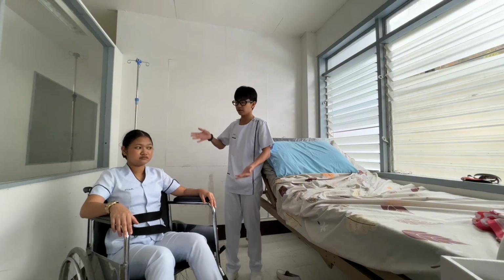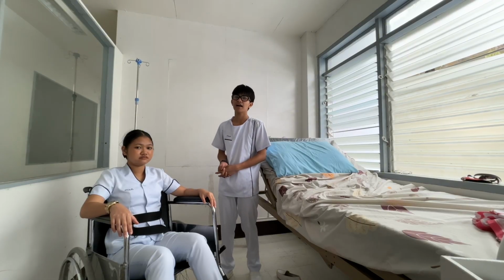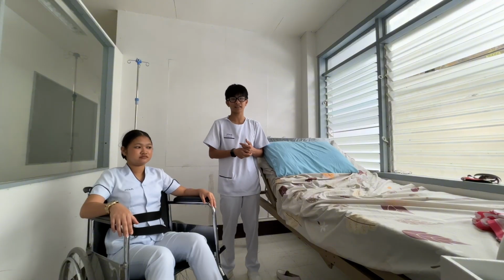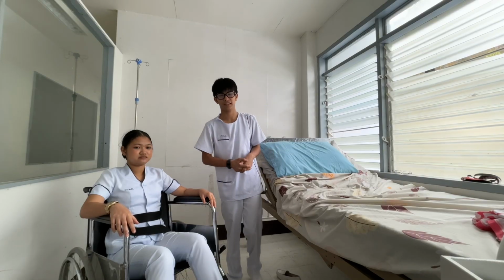As the client is now on the wheelchair, make the patient comfortable. Assess the patient for alignment in the wheelchair, cover with a blanket if needed. Then perform hand hygiene and document the findings and the client's activity.